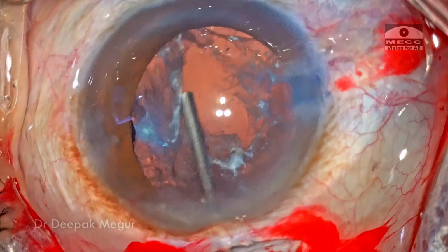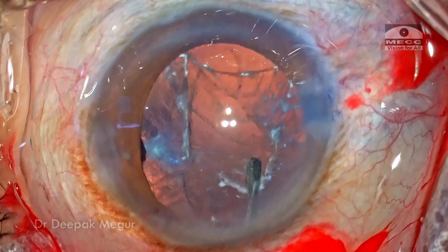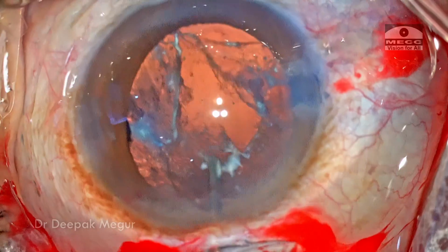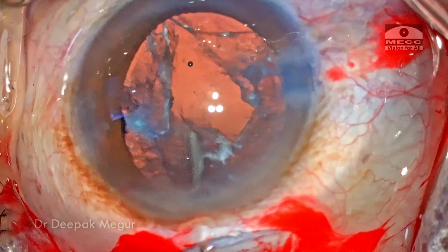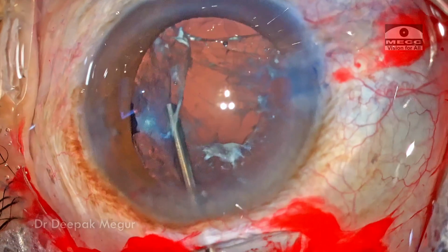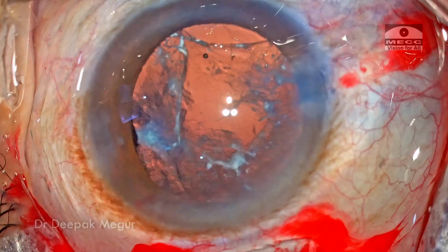I know the capsular bag is very flimsy and trying to fold across, but I think this is a very gentle way of trying to clean up the posterior capsule. Thankfully, the tear in the equatorial region is not extending, and now it looks like I still have a decent opportunity to place a posterior chamber lens over this anterior capsule.